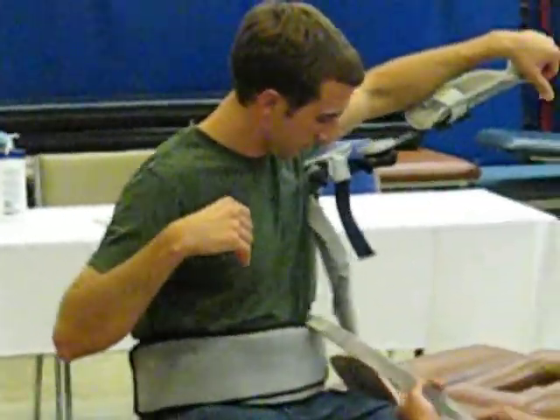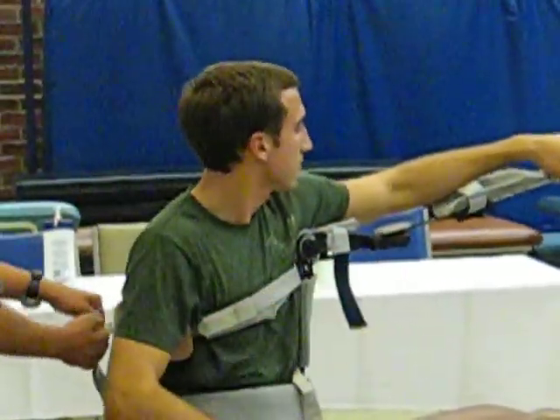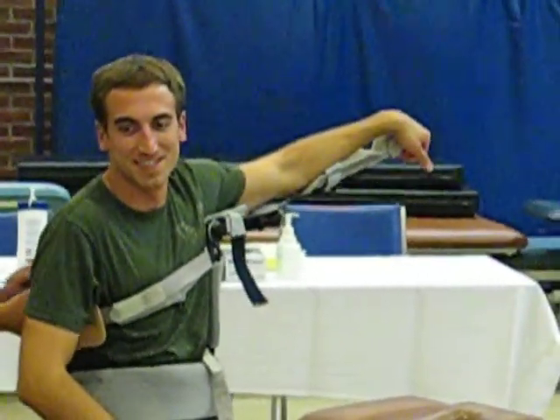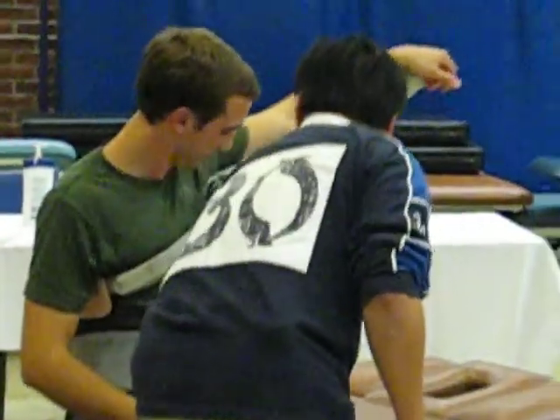Okay. So a nice little strap there. I apologize — it may not be the perfect anatomic position, because sometimes we have to adjust quite a bit to make sure it's good.